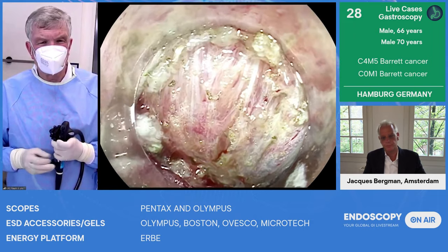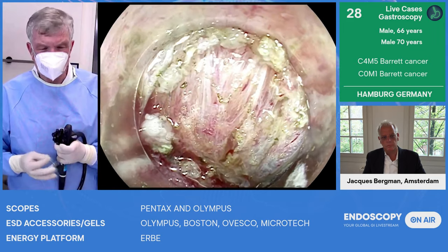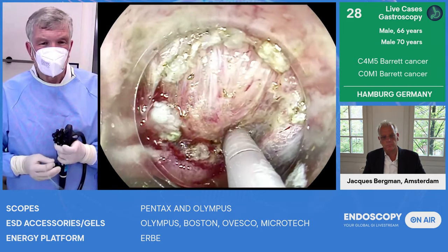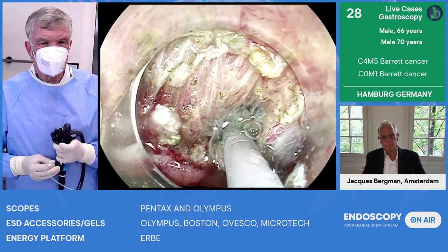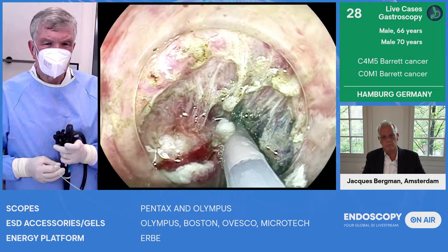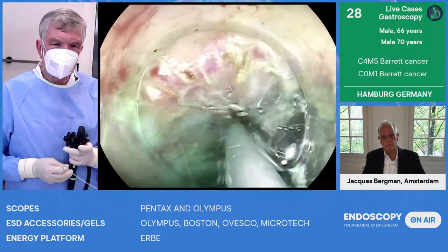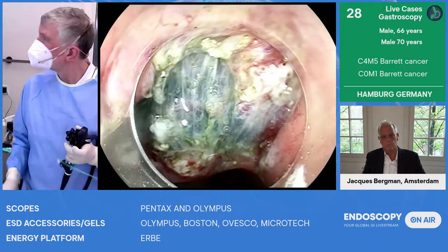Before we go to Helmut, we show you both. So now comes the injection with needle in. Syringe, needle on. It also works well. See, stop. Okay, and then you clearly see it's not far enough. Stop. And now the dual knife again.